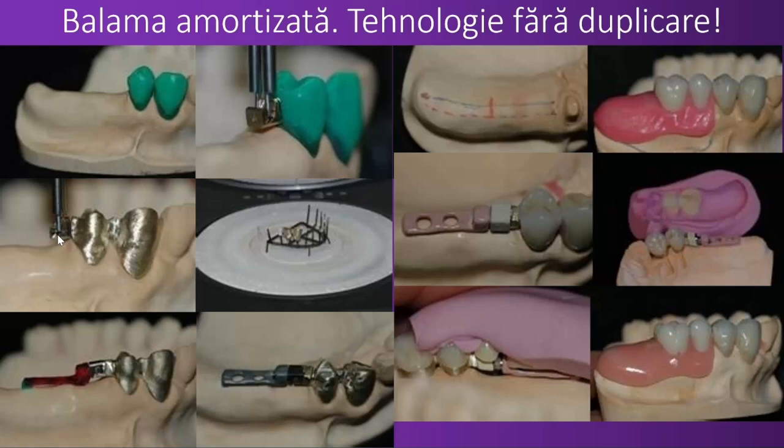So this position is blocked into position with investment material, and then you see this is where you put it in the furnace, placing a little pellet of gold that at the high temperature will simply fill the gaps and solder the two parts. That's amazing how they do it, but this is only able to be done in gold, right? Stainless steel, no way.